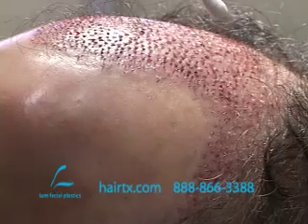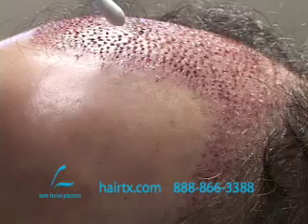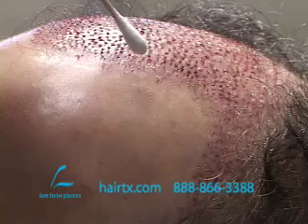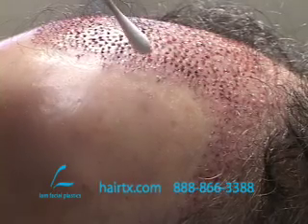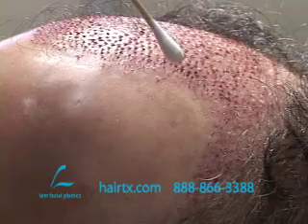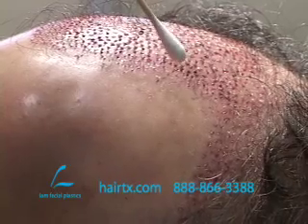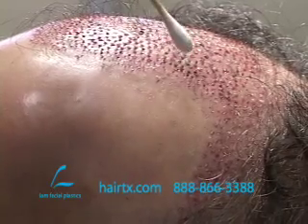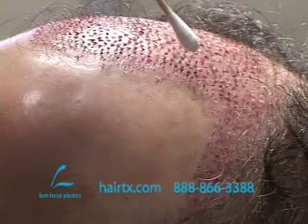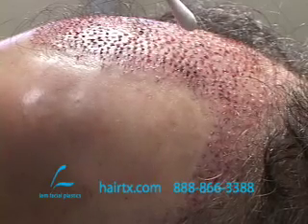And we've carried that concept all the way forward, almost to the hairline. When you're at the hairline, you don't want to do that. We use very, very small slit sites, sagittal slit sites. But as we go back about a couple centimeters, these are micro punches that are 0.75 millimeters. So you can imagine, extremely, extremely tiny. But again, being able to do almost a one-to-one, if not a little bit more favorable than one-to-one, exchange of bald scalp. And then staging that back, going into a 1 millimeter punch graft removal of bald scalp, and then going back into the central density corridor of 1.2 millimeters.